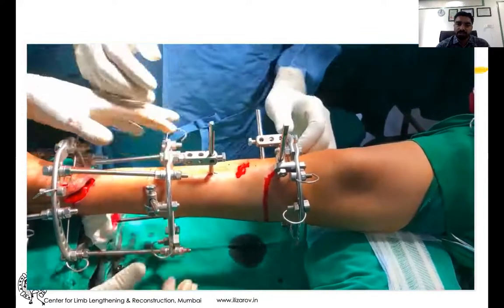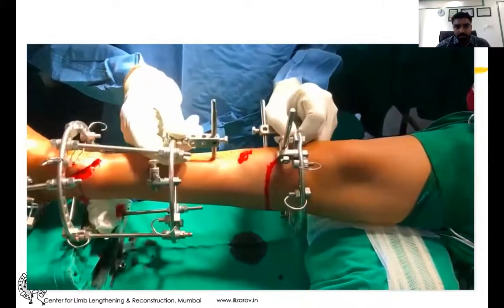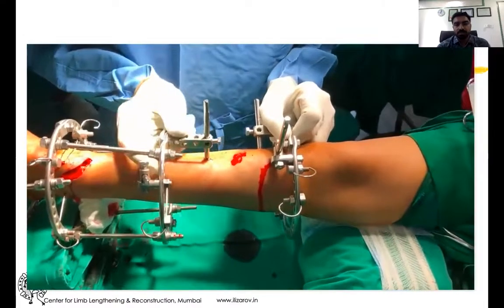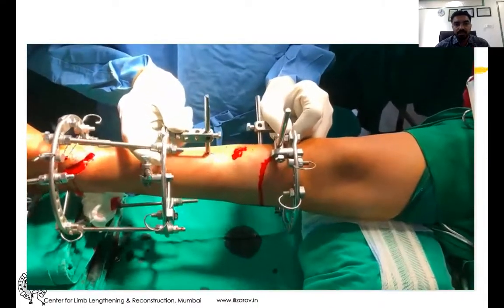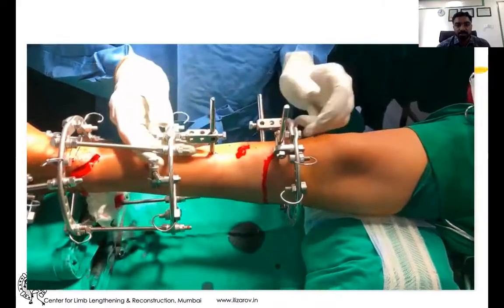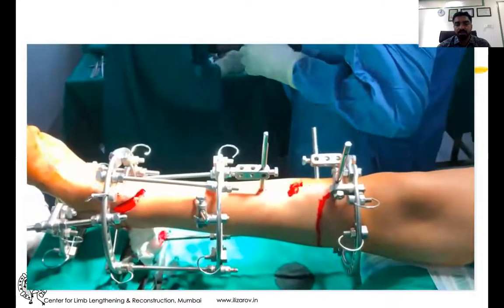You can see under the C-arm as well. You can appreciate the osteotome position. Now with no rods connected, the opposite directional movement of rings and the translation movement shows that our corticotomy is complete.